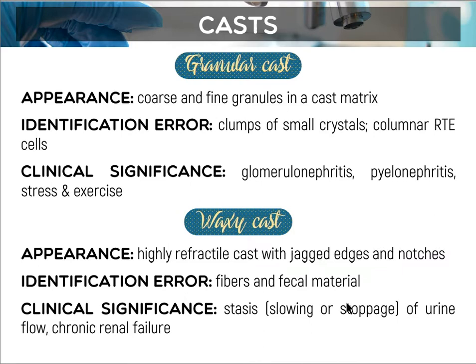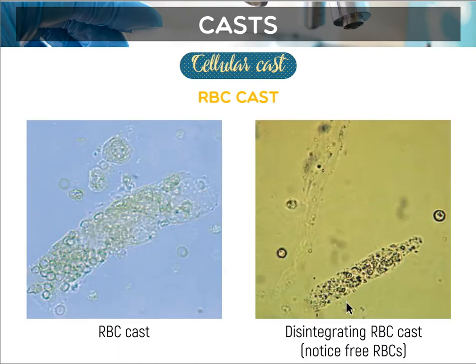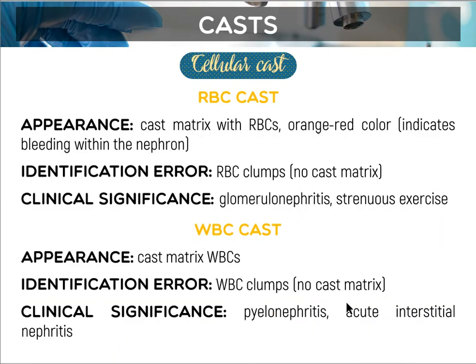Okay? And then, sorry guys. Sorry, I forgot to mention this sa inyohang WBC cast. Alright, so di ba we have your pyelonephritis. So imuha ni siyang upper UTI. So di ba usually sa kidney ni siya. So naa siya WBC cast, naa siya WBC ug bacteria, okay?